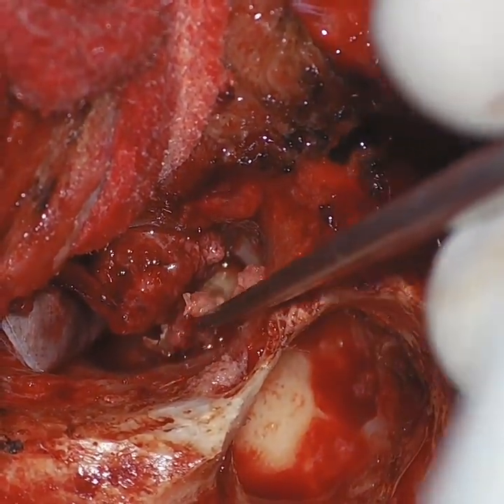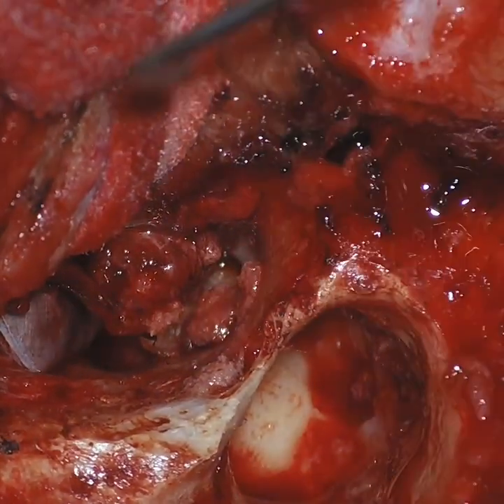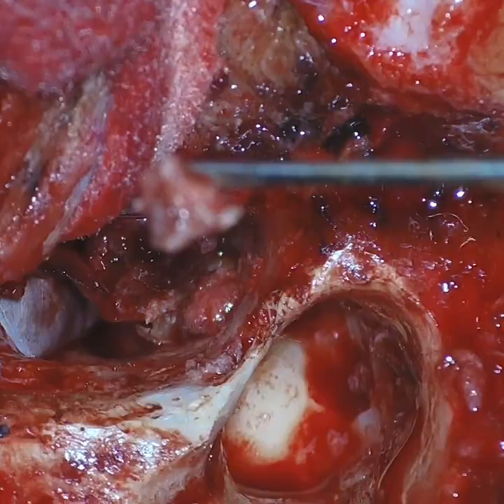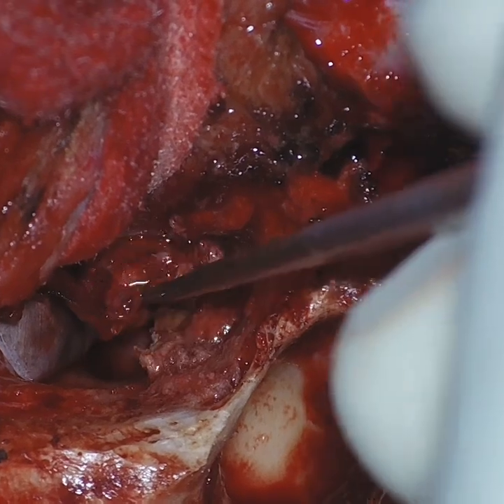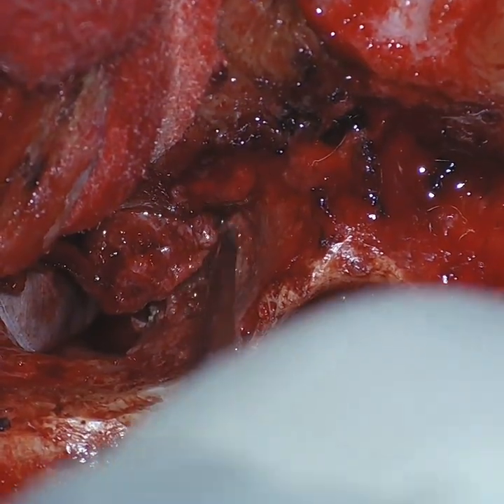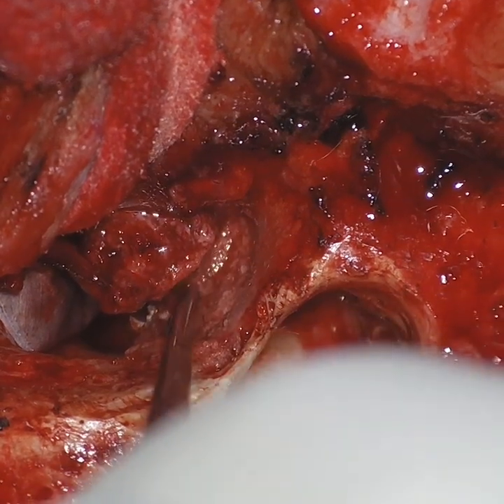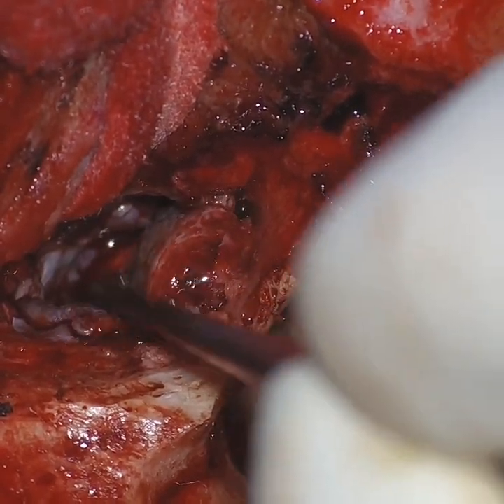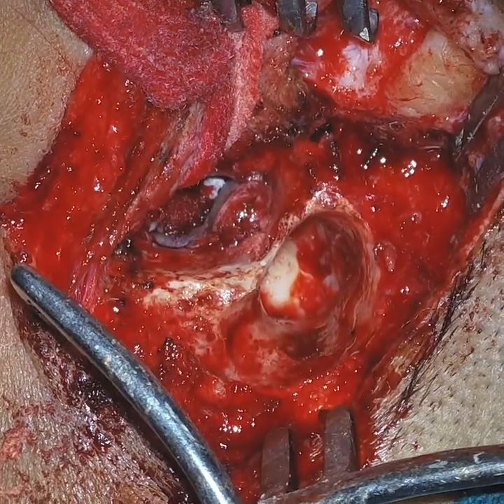2-point fixation. And then we use a lot of bone pate, so the minimal attic defect which was made is obliterated with bone pate. It is an excellent material for minimal obliterations, particularly bony obliterations. And once we repair the attic, gelfoam is placed, and confirmation was also done from the posterior route. Thank you so much.